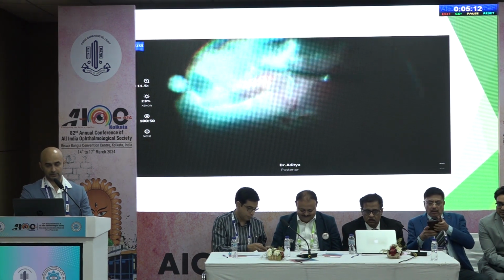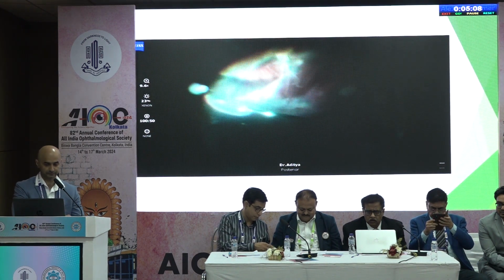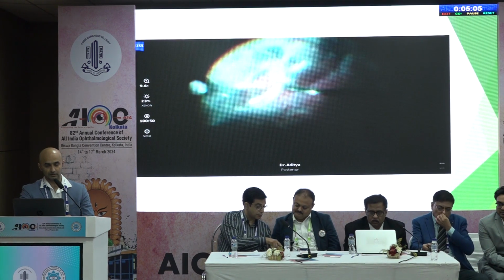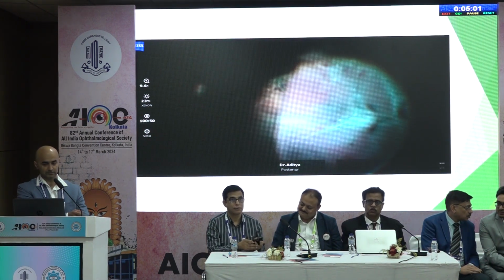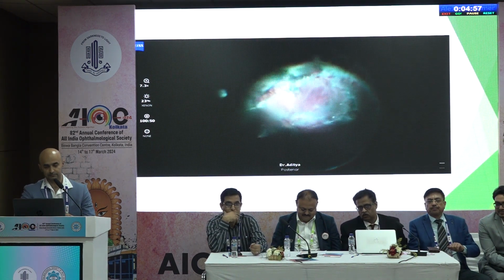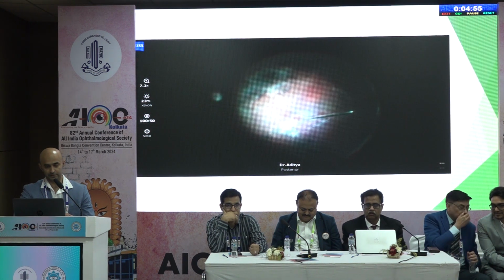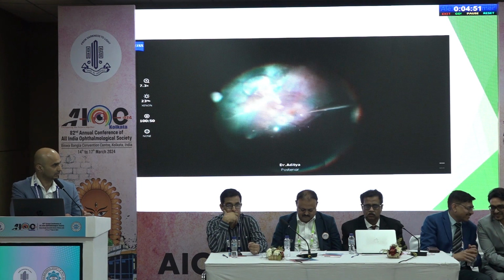And as you can see, a silicone oil globule starts to pop out of that area. Now my silicone oil cannula cannot reach there. So obviously the cutter was taking too long to remove it. So ultimately that area was drained. Then I put back PFCL to allow more silicone oil to come up anteriorly.